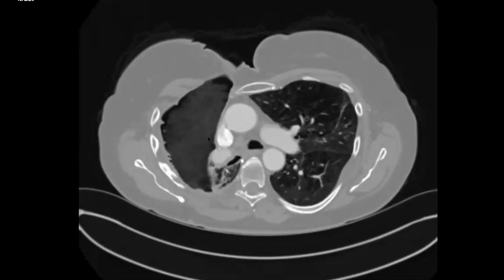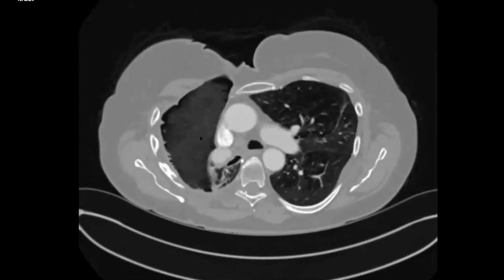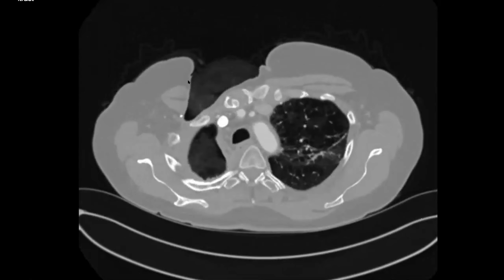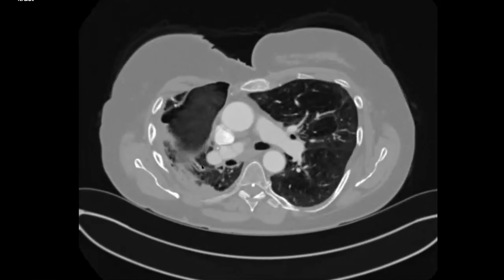And so the patient had a partial pneumonectomy. So you can see they still have their right lower lung. And then this basically huge open cavity with packing material in it. So that's what we were seeing on the plain film. So this is all gauze in here. And then their chest is basically just open. So I hadn't seen this before.